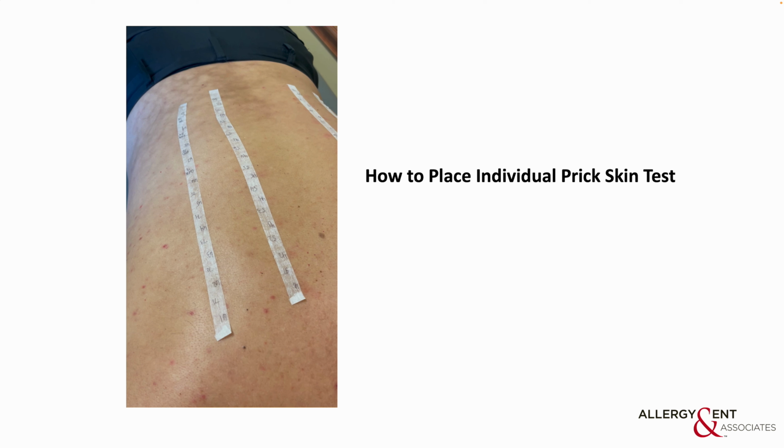Also remember that the upper part of the back, right here, is the most sensitive part. Which means that's the best place for you to place the test, while the lower part is not as sensitive as the upper part. But it's fine. You have to do it all.